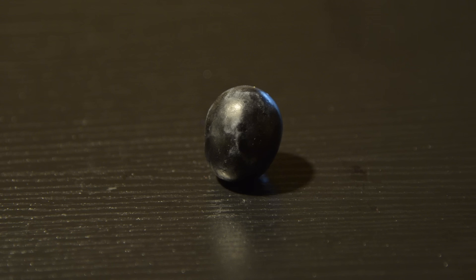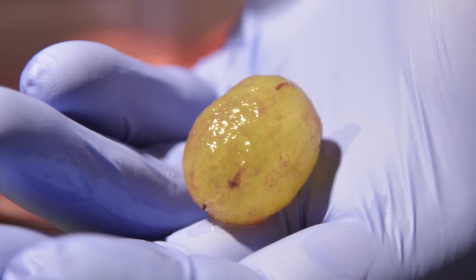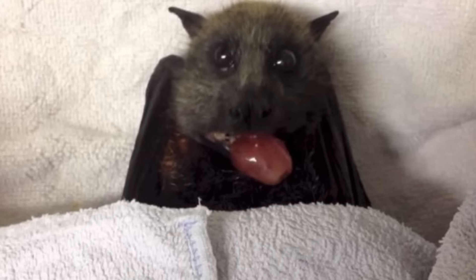This is a grape. Not that exciting, I know. If we remove the skin, a grape is basically just a big bag of the most delicate, spongy matrix, made primarily of cellulose and lignin. In the voids of that spongy network reside the living cells of the grape, and generally, they're pretty tasty.